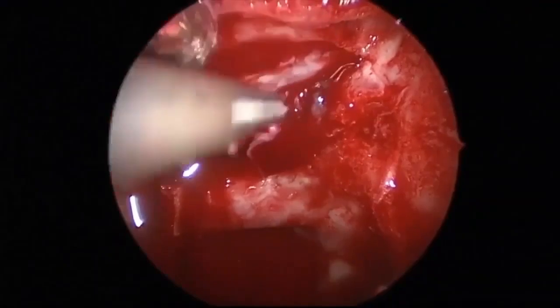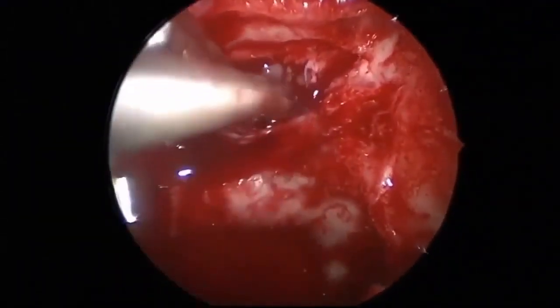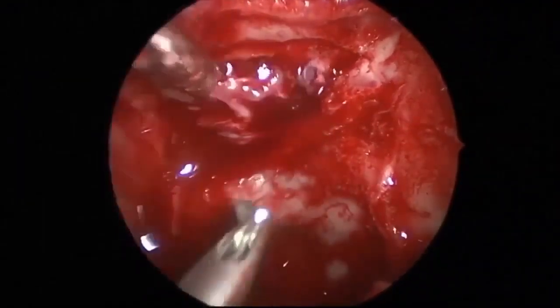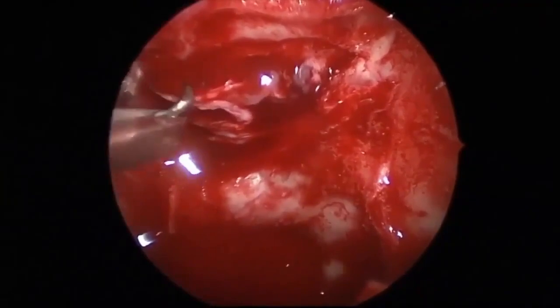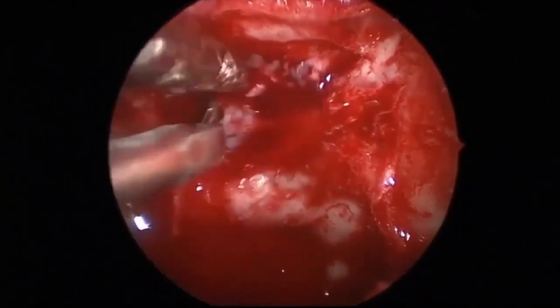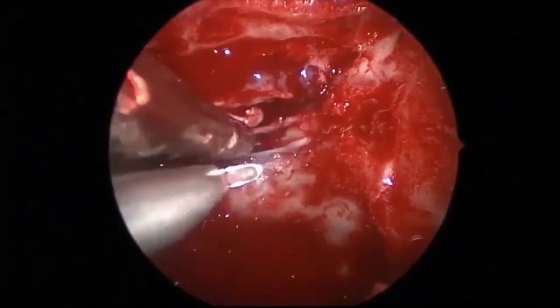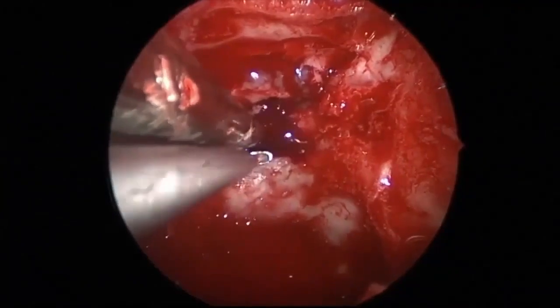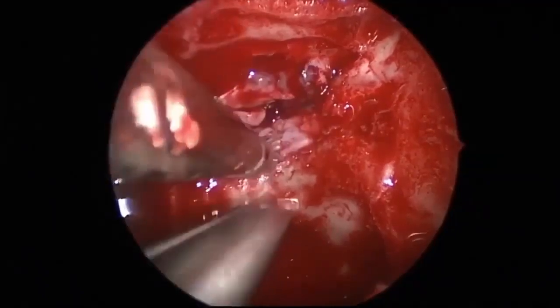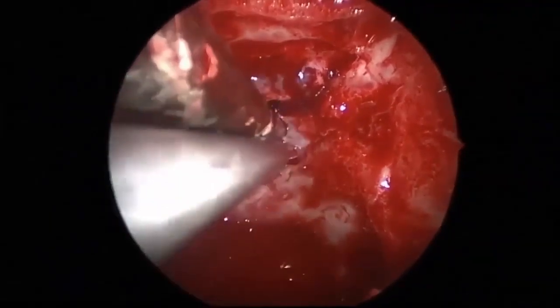We want to go all the way to the anterior edge of the tumor, where we can begin to roll the tumor down into the cavity, first working above the tumor. The dura is opened on either side to expose the base of the tumor. This opening is extended down to the superior intracavernous sinus. A little bit more of the sellar bone has to be removed in order to get below the diaphragma sella, and this is done with a Kerrison.